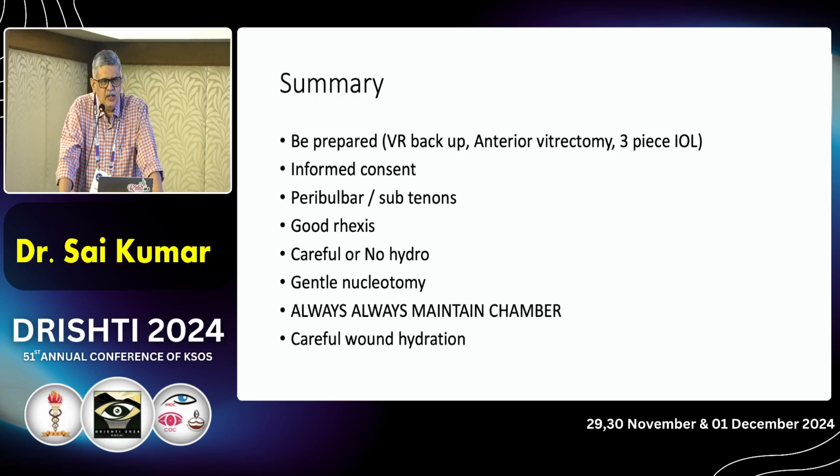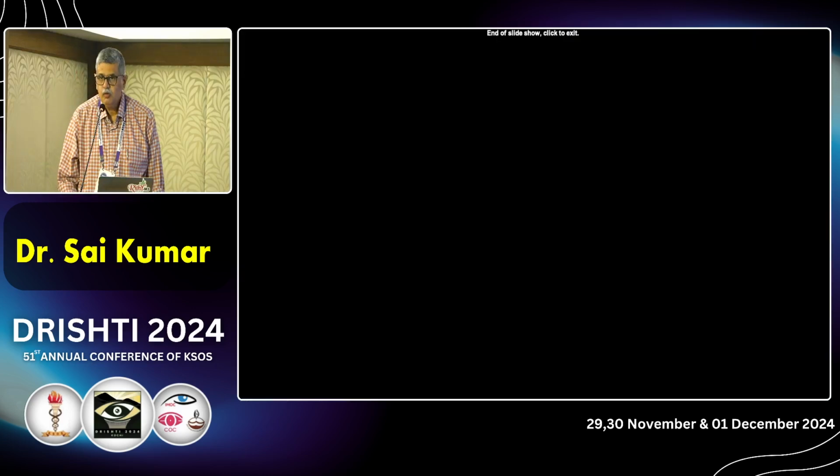And even the last wound hydration, don't take off your vigil from the eye. Normally once we put in the intraocular lens, we are sort of, okay, the lens has gone in, now nothing is there to happen. So even the wound hydration, you have to be very, very careful and make sure you don't hydrate the wound or make the chamber very, very tight. So these are some PPC with PC rent experiences I thought I'll share with you. Thank you for your kind attention.